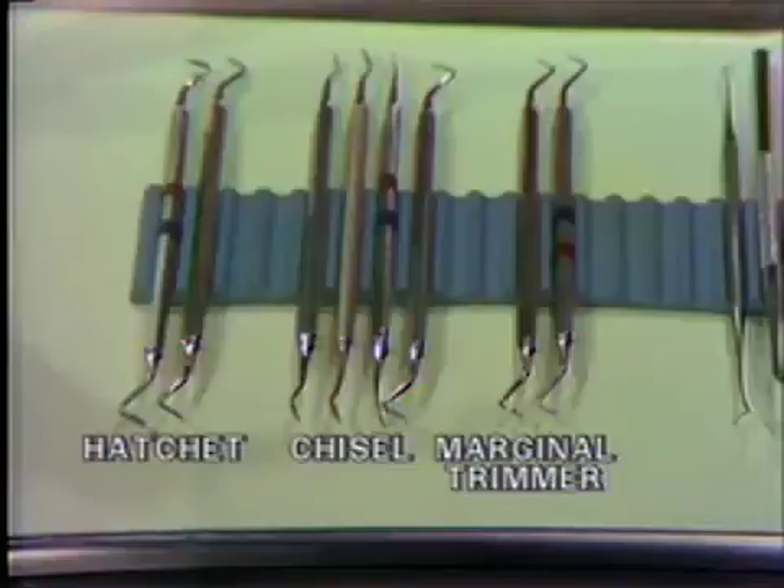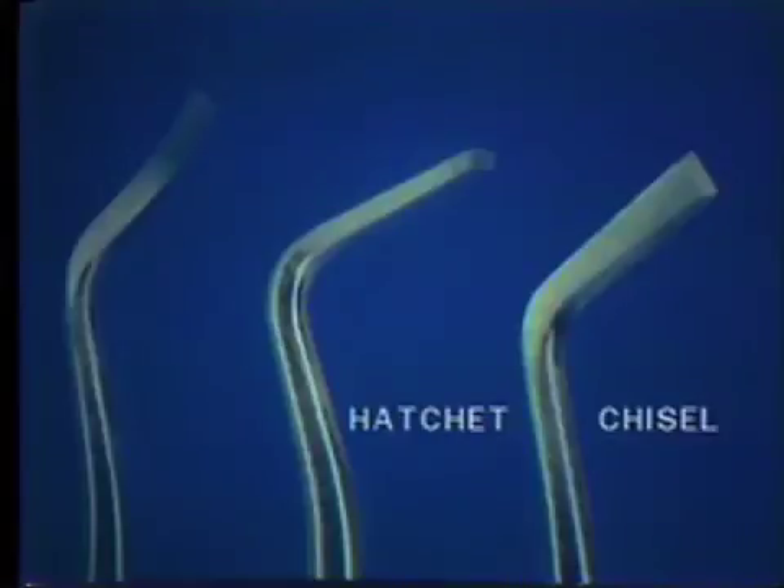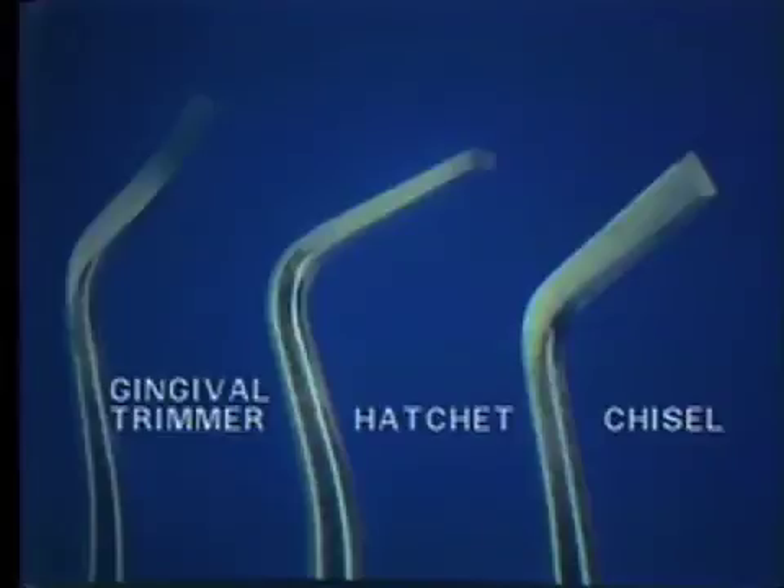On a close-up, reviewing briefly the difference between the chisel and hatchet in reference to the blade position: on the right is a chisel in which the cutting edge is 90 degrees, or at right angles, to the plane of the instrument. The instrument in the middle represents a hatchet in which the cutting edge is in the plane of the instrument. The instrument on the left is a gingival trimmer, which is a modified hatchet, with modifications being the curve to the blade and the 95-degree angle of the cutting edge to the central axis of the tooth.